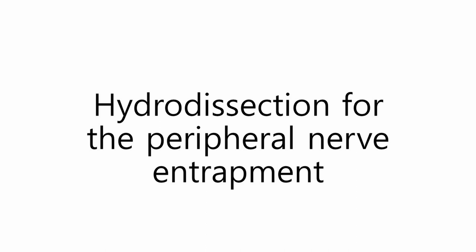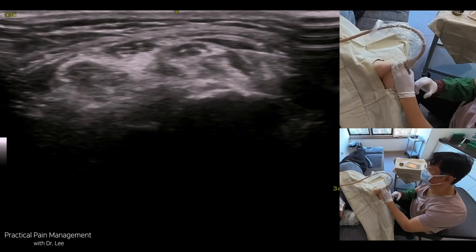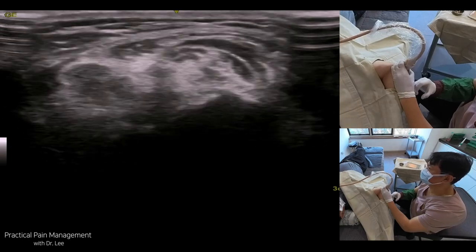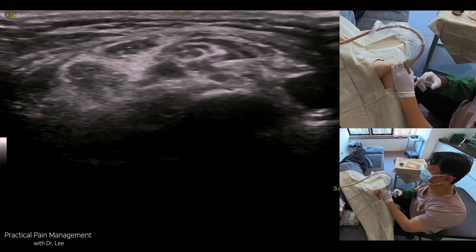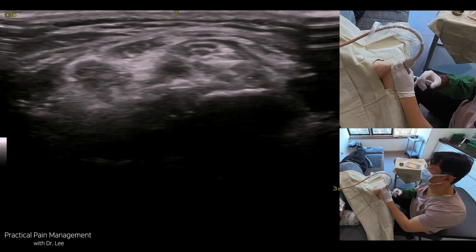Hi, Masterclass members. I will discuss the hydrodissection technique in several clinical cases. I usually undergo hydrodissection perineural release in simple peripheral nerve entrapment cases, but I try to decompress the nerve or tendon by the direct retinaculum or ligament cutting procedure using the needle blade in chronic intractable nerve entrapment or tendon entrapment cases.